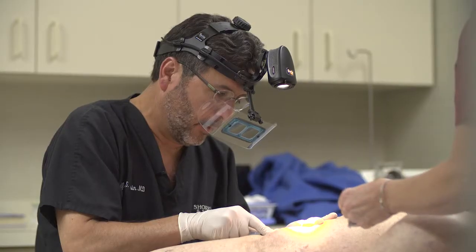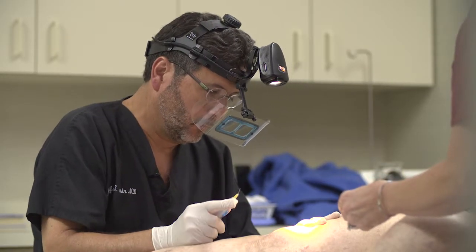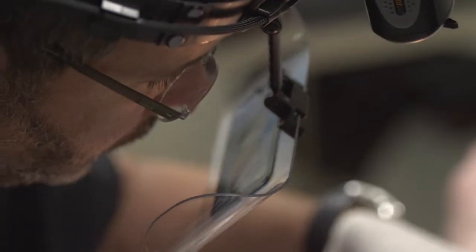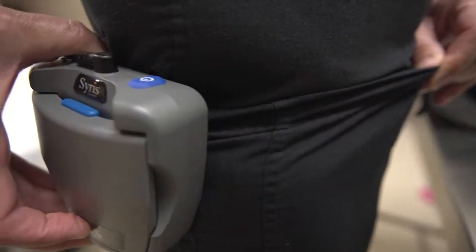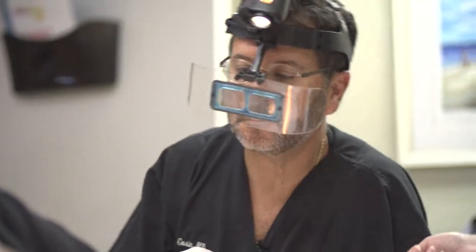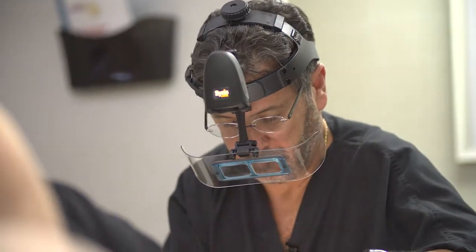It cuts out all the glare and really just demonstrates the telangiectasia of the spider veins. We also get a little bit of magnification with it as well. It's powered through a battery pack which clips onto my belt, so I'm not tethered to the wall, and it allows me to move around the procedure table easily.